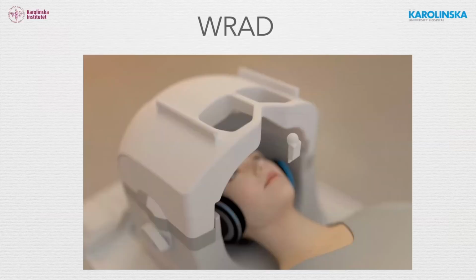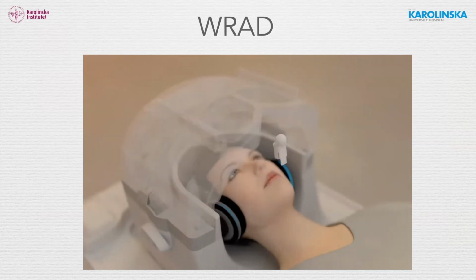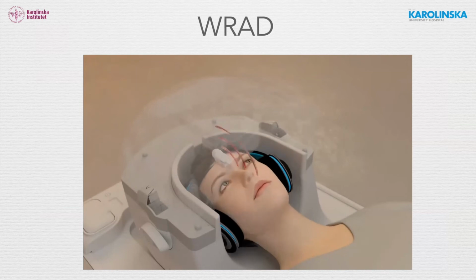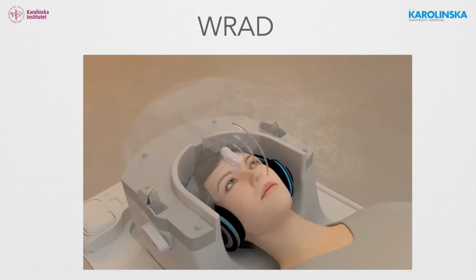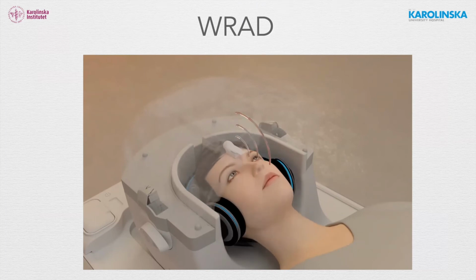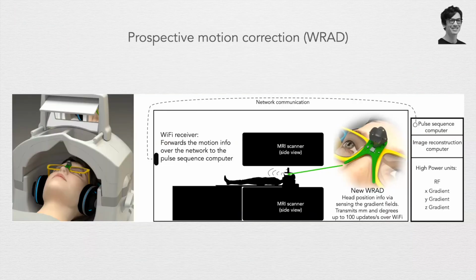Our device, which we have made in our group, credits to Adam van Niekerk again here, is the device you put on the forehead, either with a padding or a plate or no plate. And then it sends out Wi-Fi, homemade Wi-Fi, to a receiver, which is fed back to the acquisition process in the equipment room. So basically like this, you have a receiver, and then you have an Ethernet cable running back, and then it adjusts the field of view in real time.